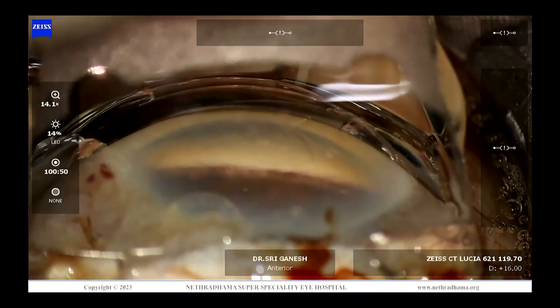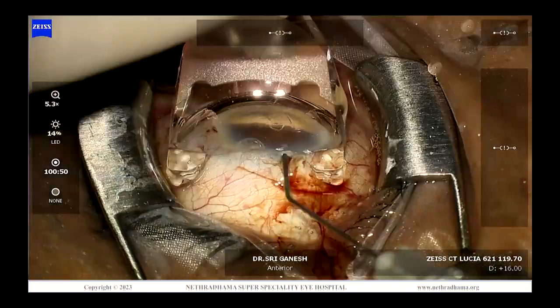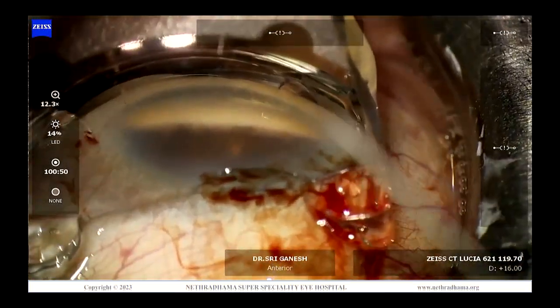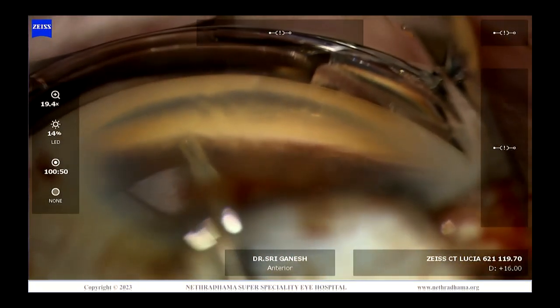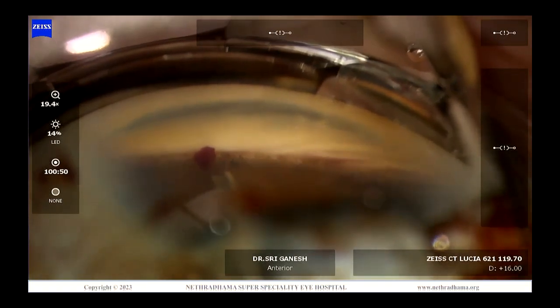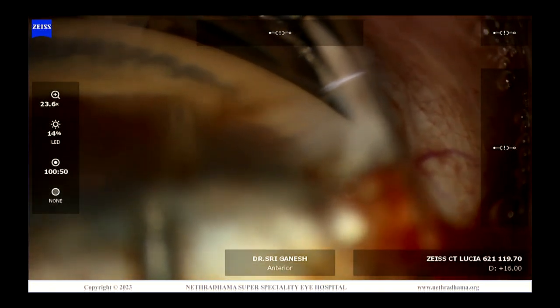This patient was a high myope, and in high myopes this happens where the eye is more compliant, and unless you inject visco and make the AC tight, there are folds which prevent proper visualization. So more visco is injected, and then you go in with the device, retract and click the button. You just need to indent the trocar slightly on the Schlemm's canal, which is identified by blood in the canal. This is the first important sign to note, a mild ooze after implantation of the device.